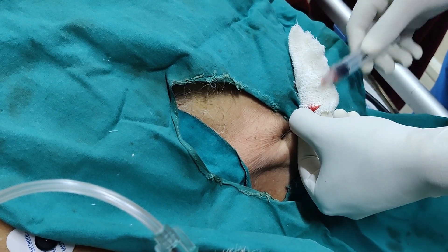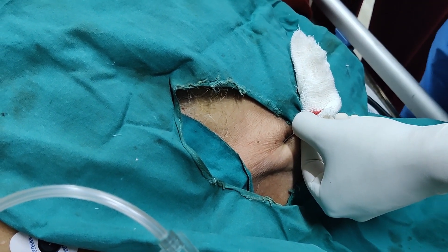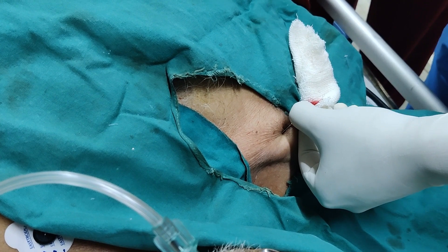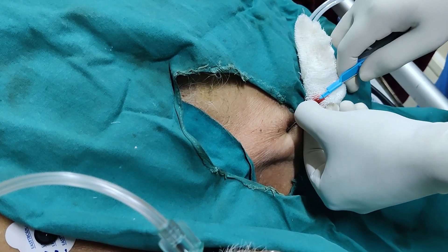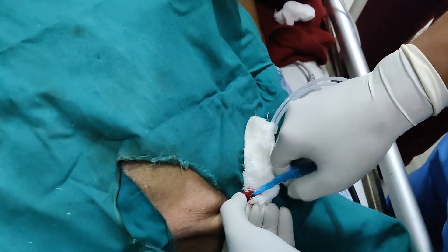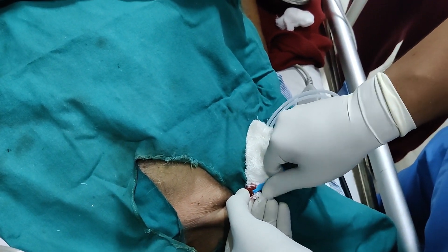Insert the J-curved end of the guide wire into the introducer needle, with the J-curve facing inferiorly in the same direction as the needle bevel. Advance the guide wire through the needle and into the vein.